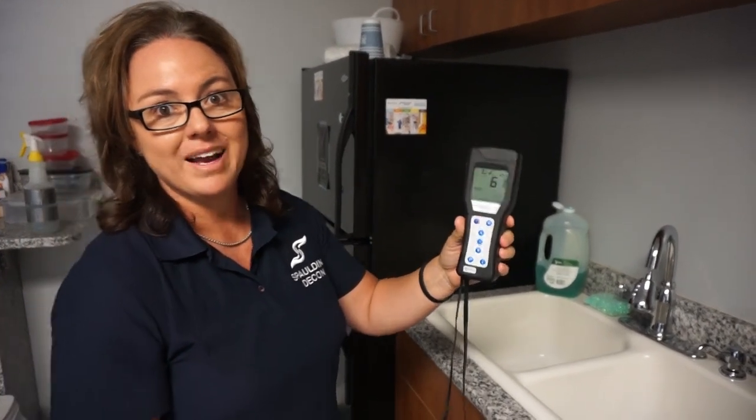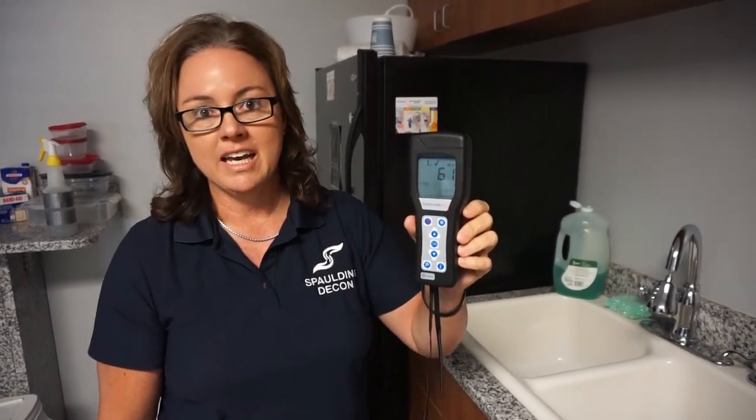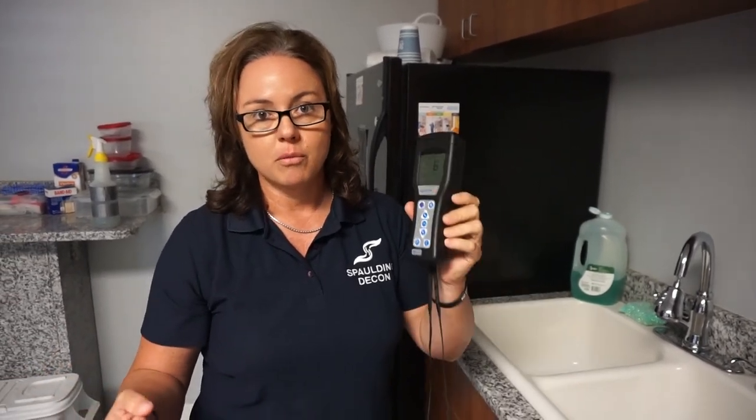Wow, we went way down — so this is awesome! I would probably give this one more cleaning and then that would take us to about 30, which is great for food prep areas. For more information on how this machine works, go ahead and see the videos on YouTube — they're really informational. This is a great tool for our business, so please let me know if you have any questions. Thanks!